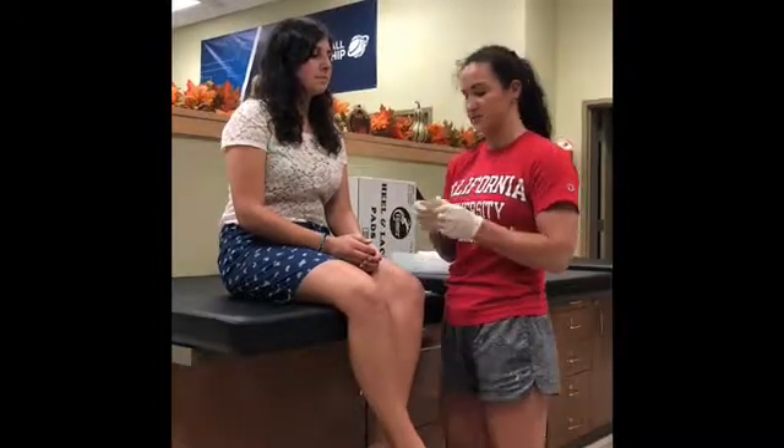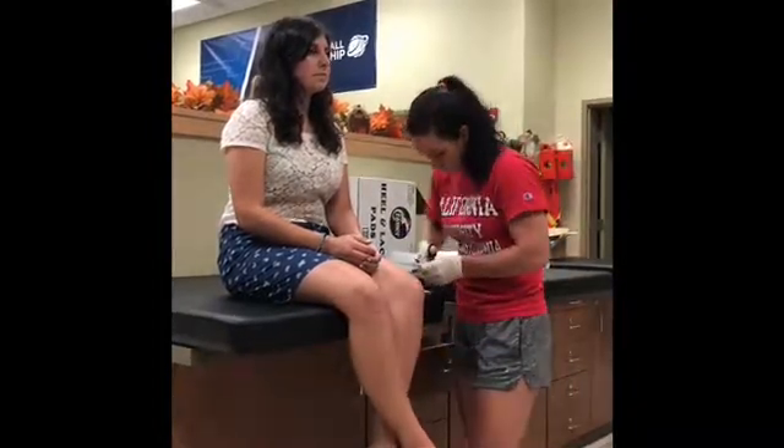Since it's on her lip, I'm going to cut this because it's too large.